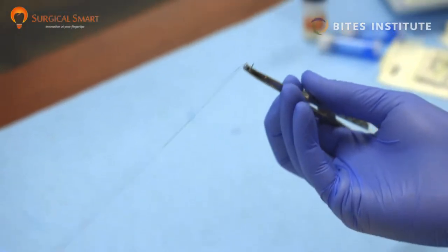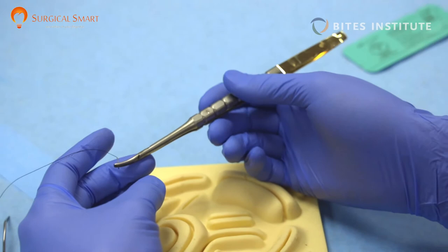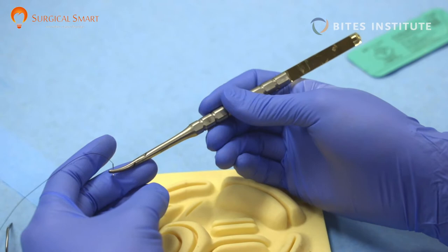I'm using my favorite instrument, Castroviejo, which has a self-locking feature. It's better than regular needle drivers because you can use just a simple press to lock the needle in and a simple press to unlock the needle.